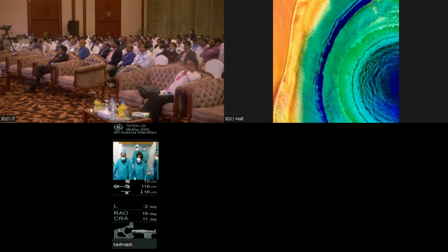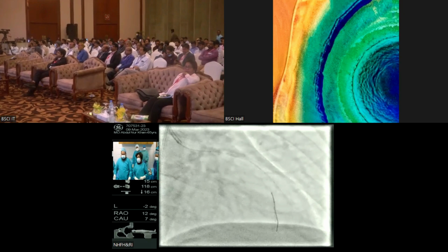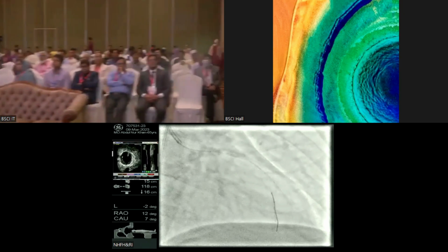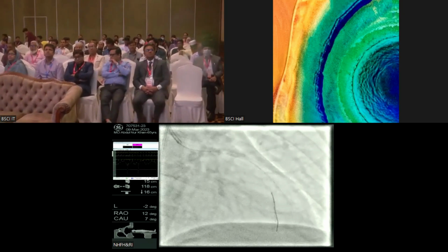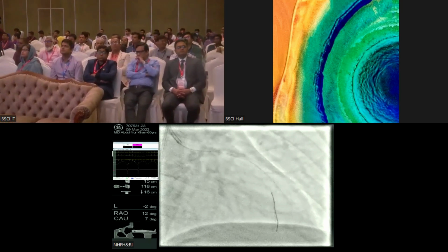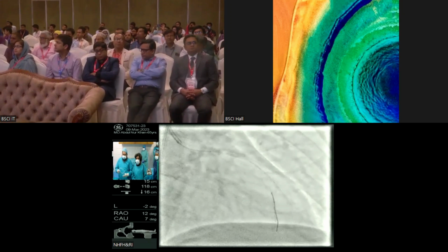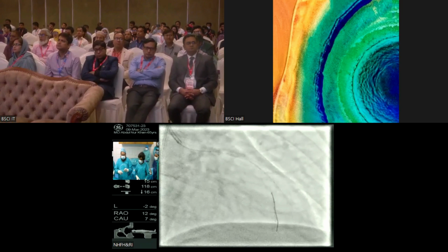And our catheter is, as you can see, disengaged, because as soon as we place our catheter, the pressure gets damped. So now we are planning to really prepare our lesion well, because that is one of the key elements of success in a calcified vessel. You really need to prepare a lesion well. And so this is what we will do, if you permit us.